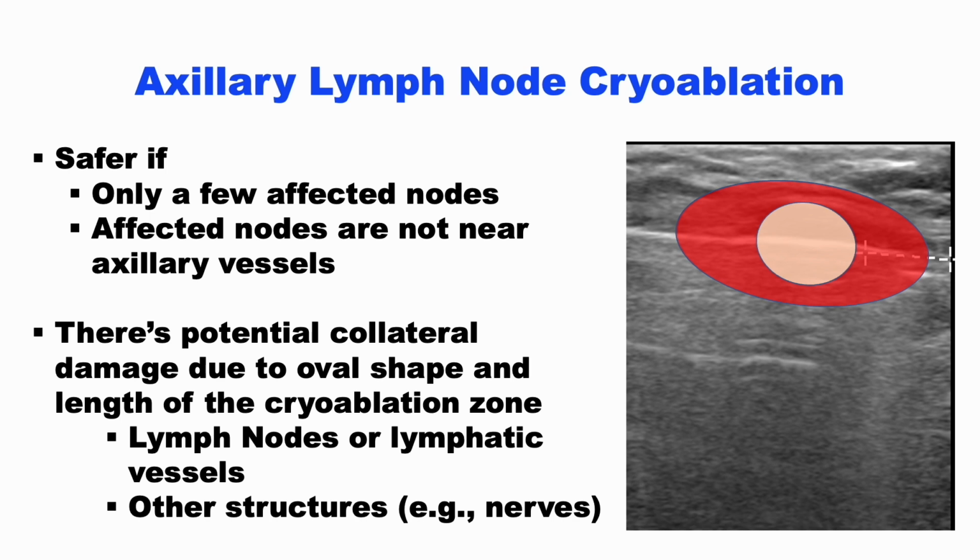The other limitation of lymph node cryoablation is that I am not able to perform axillary reverse mapping or S-lympha in these patients, since there's no invasive surgical procedure being performed to identify the pattern of lymphatic drainage in these patients.